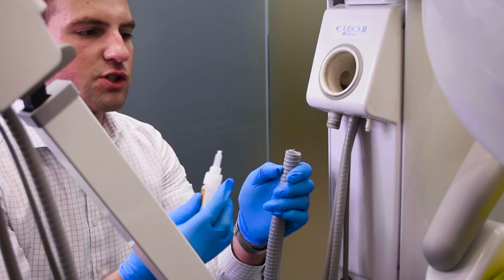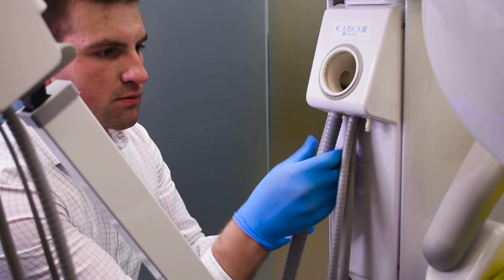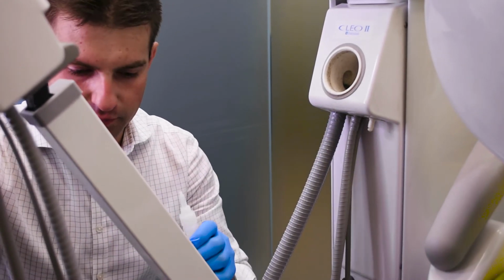Certainly don't plaster it, otherwise you won't be able to get the hose off next time. And then twist and push, and the hose goes on. Like so. Same applies to the other end.